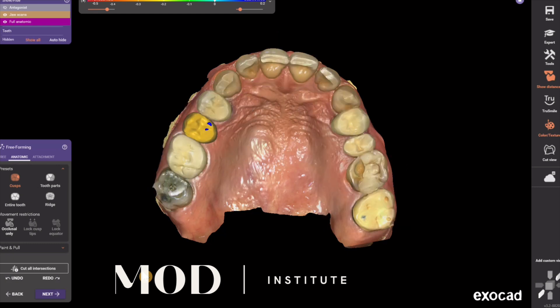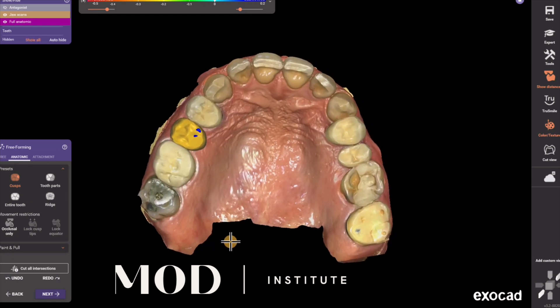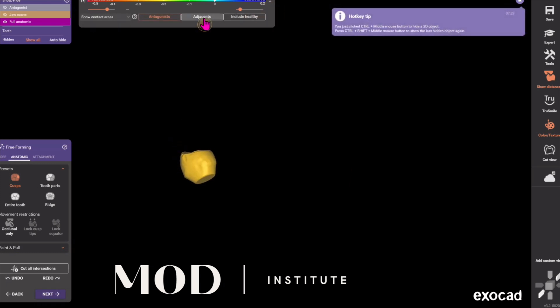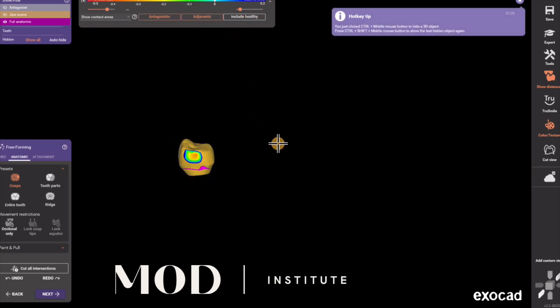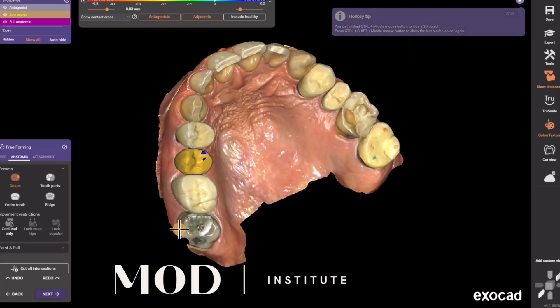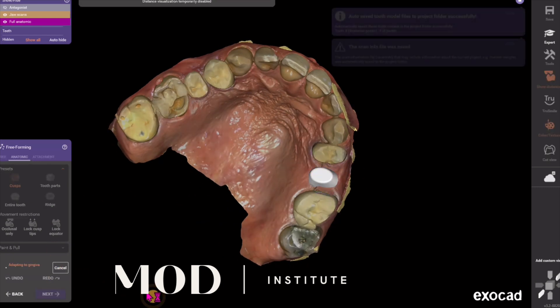The next step is the free-forming step where all we have to do is cut all intersections, which is going to adjust the proximal contact, adjust the pontic tissue pressure, and adjust the occlusion for us automatically. Hit cut all intersections and it's going to take care of all these issues.